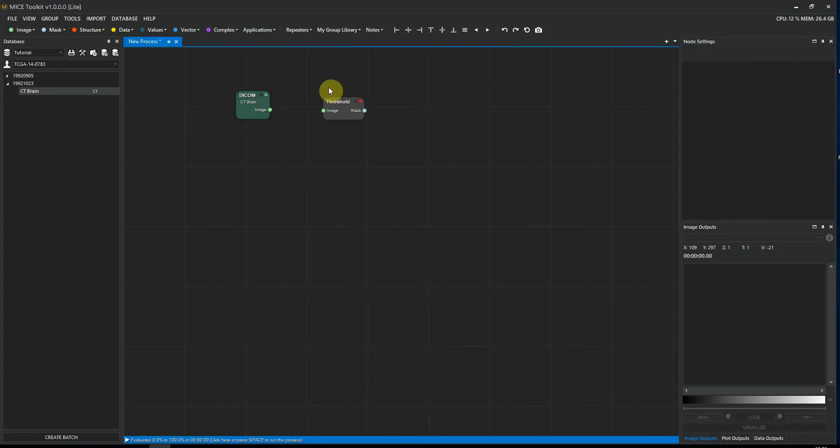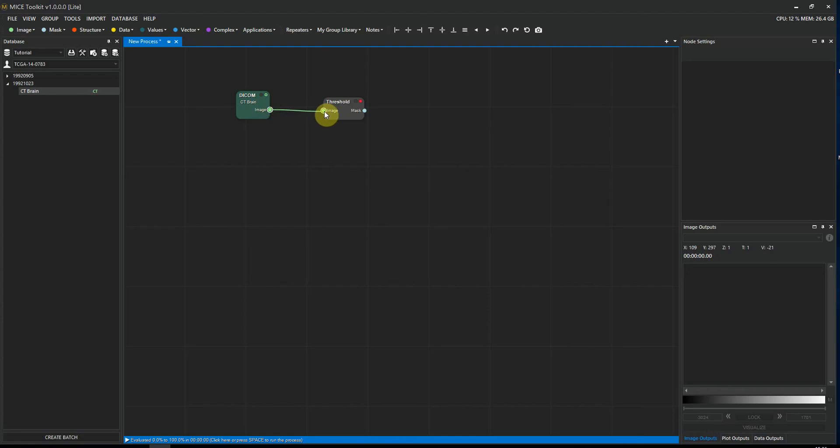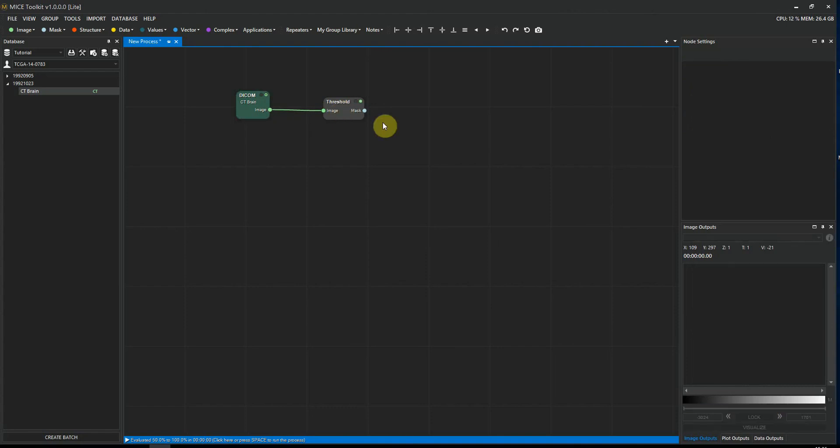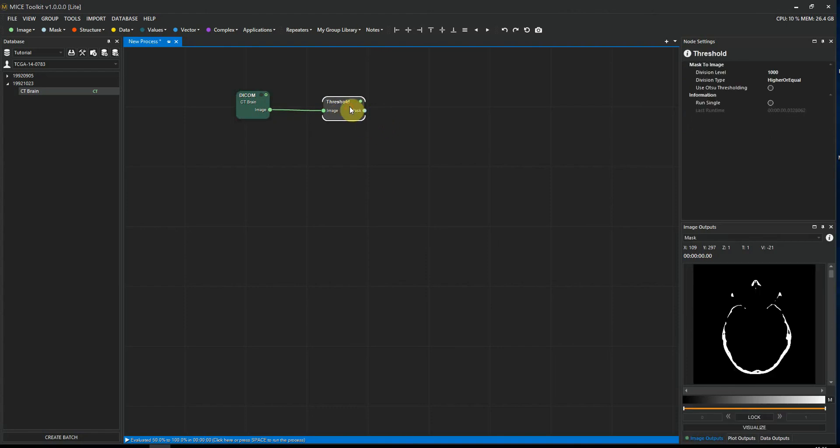So then I can connect the output from this node to the input of this node. And I do that by drag and dropping from the output connector of the first node to the input connector of the second node. And to release the node again, I just perform the same action again. So I drag and drop from the output to the input. But now we're going to execute the node. So I'm going to reconnect it and press spacebar to execute the workflow. If I highlight the node, we can see the output in the output panel again.